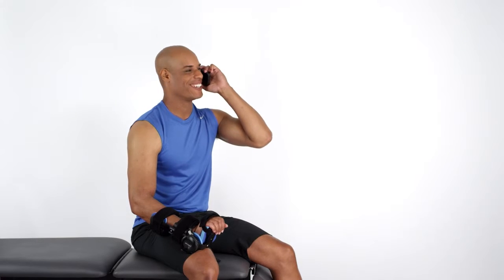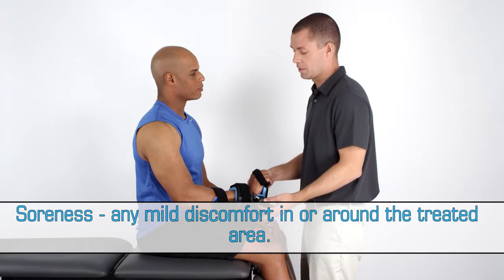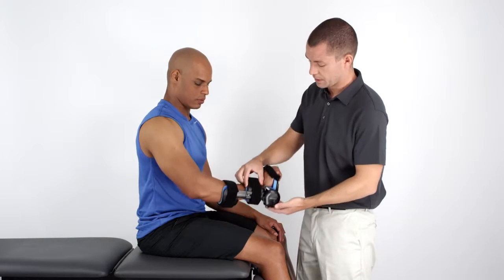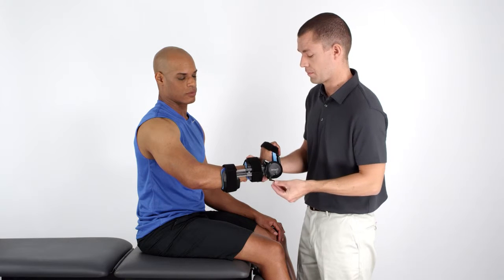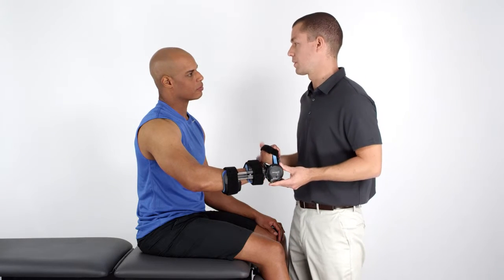Ideally, the patient should progress to the maximum wear time set by a physician or skilled therapist while at rest or sleep, in compliance with the following post-wear criteria. Soreness is defined as any mild discomfort in or around the treated area. The decision to increase wear time should be based on patient tolerance and may be accomplished over a few days or longer if necessary. Once a patient has achieved their wear time goal, a steady increase in tension may be required to achieve the patient's range of motion goals. If there is minimal soreness and no range of motion gains have been measured, then tension should probably be increased. Increase the tension gradually, no more than one increment per evaluation, and make sure the patient is maintaining the required wear time per day and adhering to the post-wear criteria for soreness.